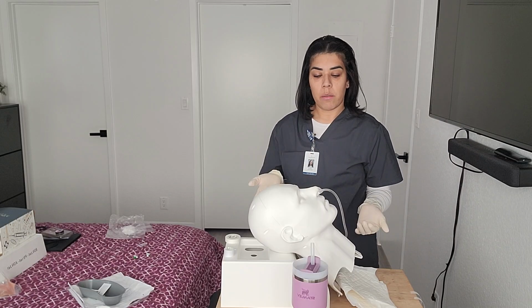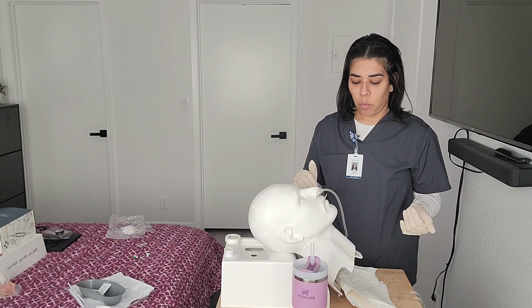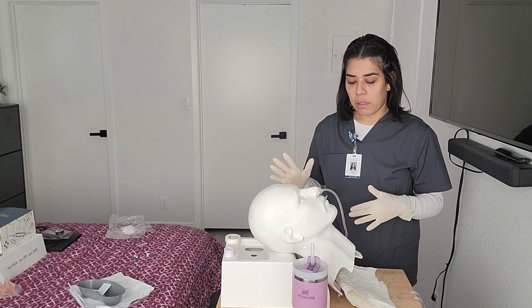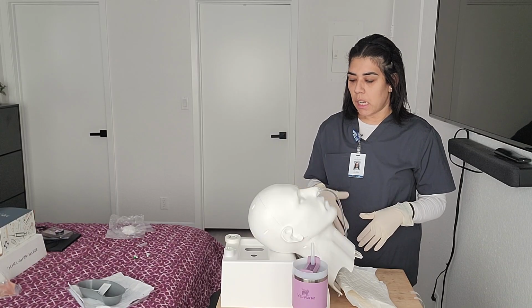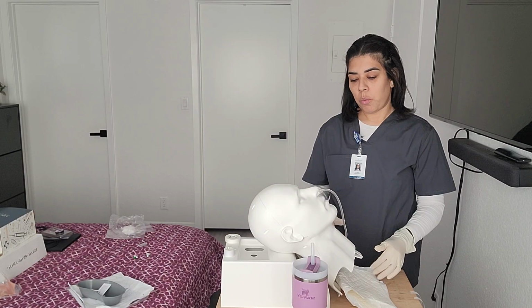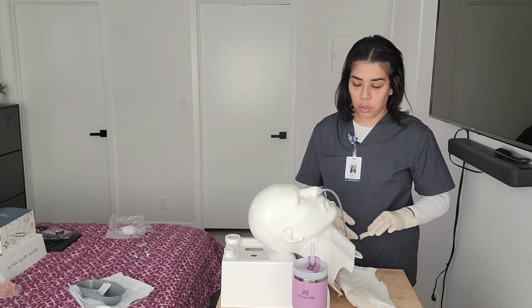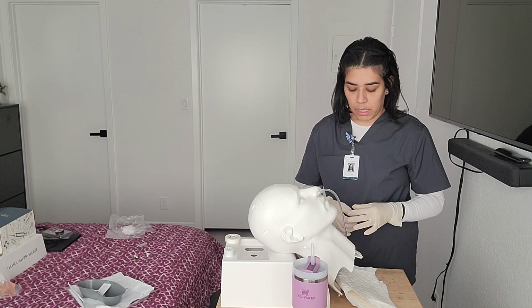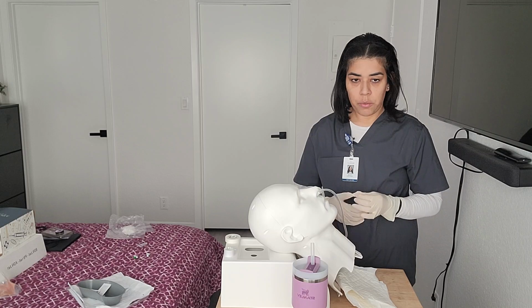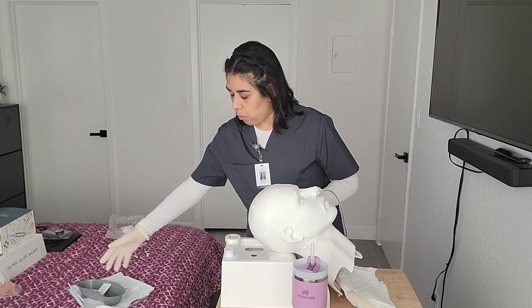Before you leave, you ask the patient if you need anything. Okay, Mr. Manny, everything went well. The tube placement is in the correct place. The head of the bed is elevated. Your call light is within your reach. If you need anything, please go ahead and call us through the call light. But before I step out, is there anything else I can do for you? Okay, so the patient says no. He just wants to rest.